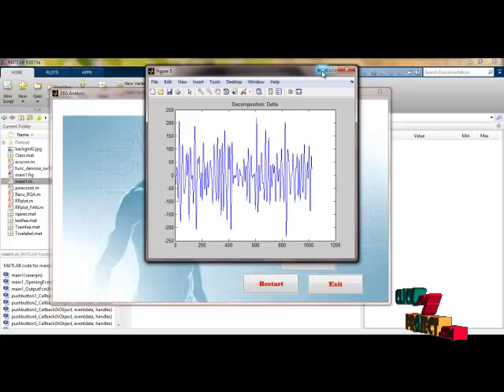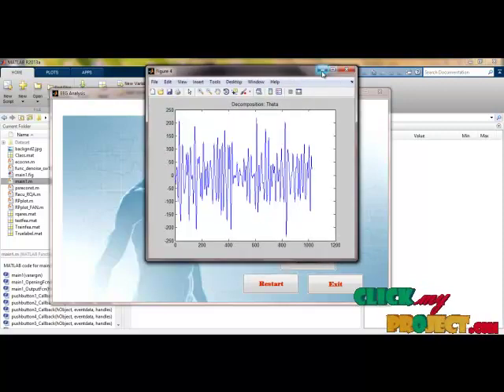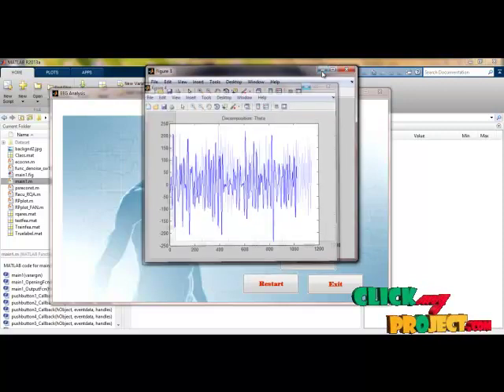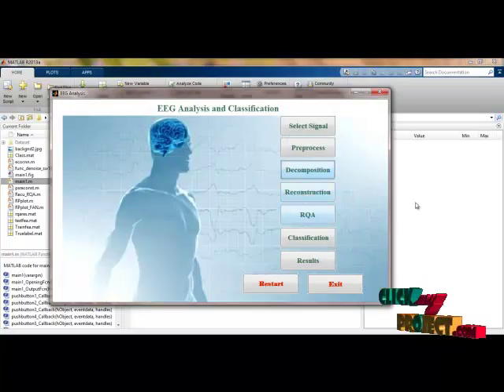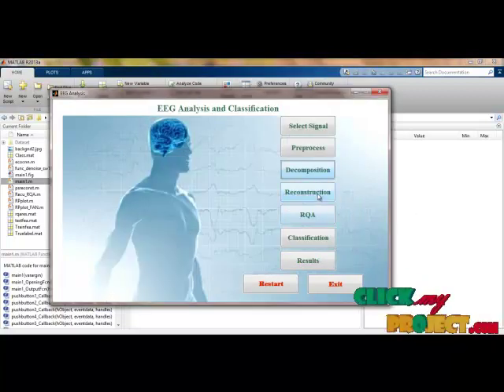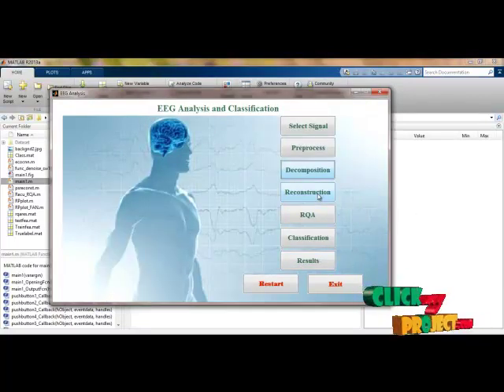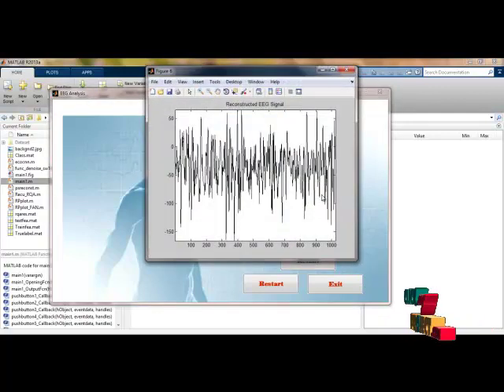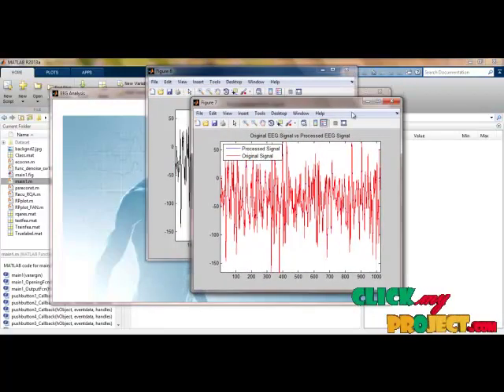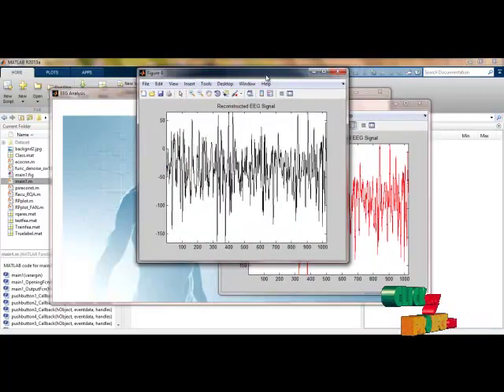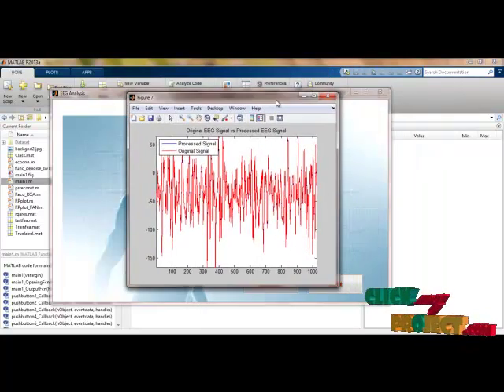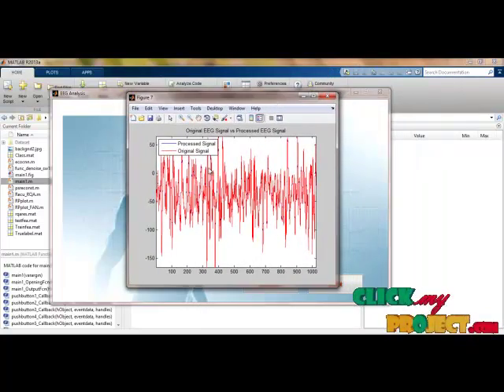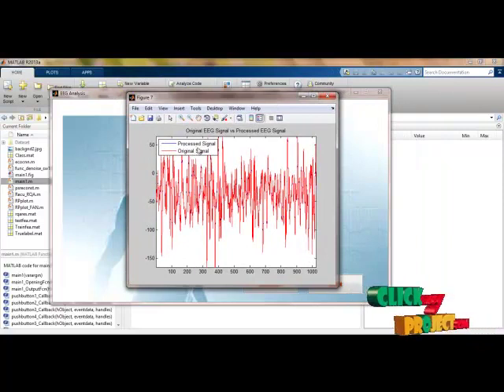As already discussed, the decomposition levels are delta, theta, alpha, beta, and gamma — these are the decomposed signals. We then reconstruct the decomposed signals. You can see the difference between the decomposed signals and the original. This is the reconstructed EEG. By zooming in you can see the difference: the blue color lines are the processed signal and the red colors are the original signals.